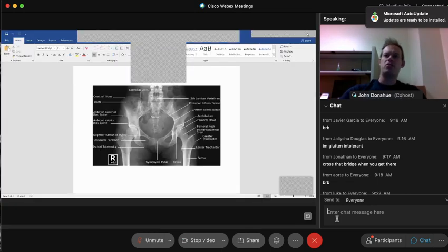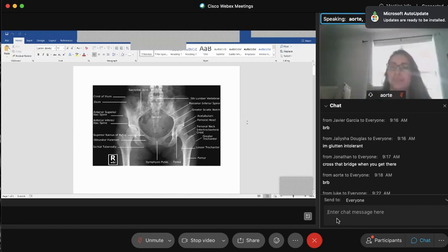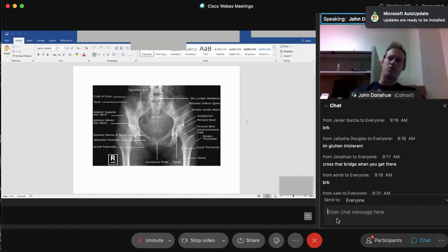Okay, ready, guys? You got your sheets ready? Write these down. Okay, well, you tell me. What is that? You should all be able to tell me what that is. AP pelvis. AP pelvis. And that's what you'd call right there, guys, a money shot x-ray. Not just for me, but for registry. They will put a picture like that on your registry. And there are so many questions they can ask on that one x-ray right there. Make sure you know that x-ray to a T. There's tons of anatomy. Every piece of anatomy on that x-ray is important to know. AP pelvis, guys. AP pelvis.